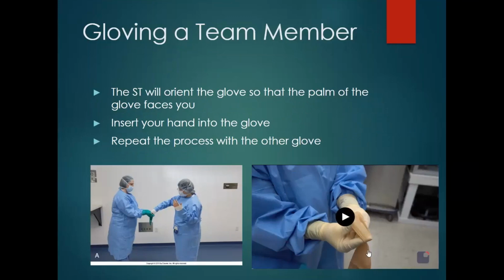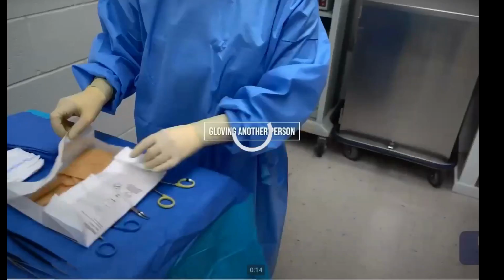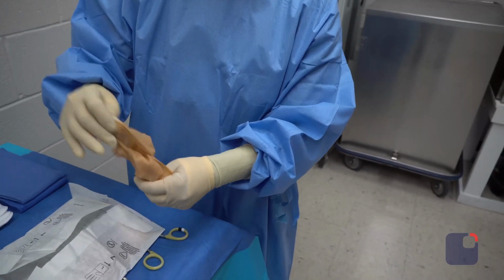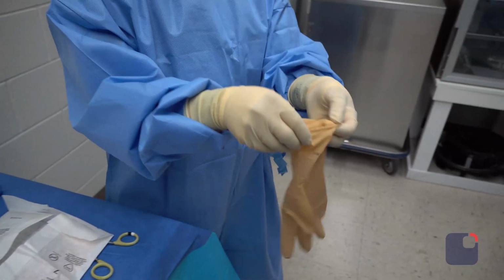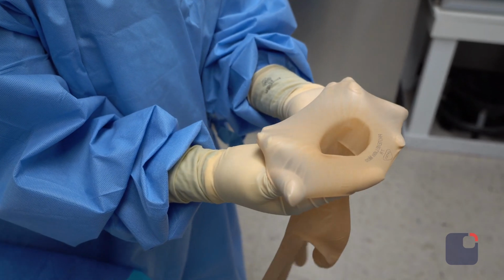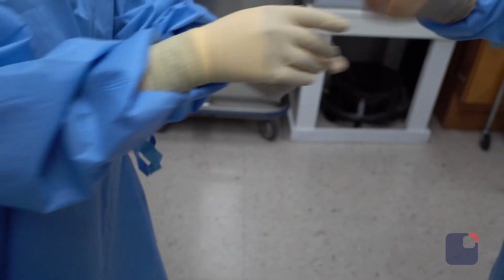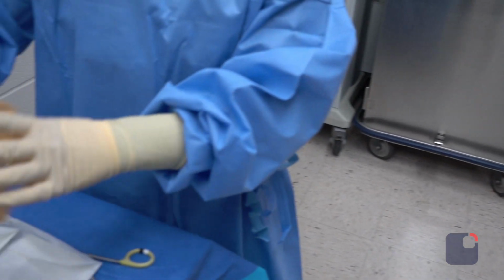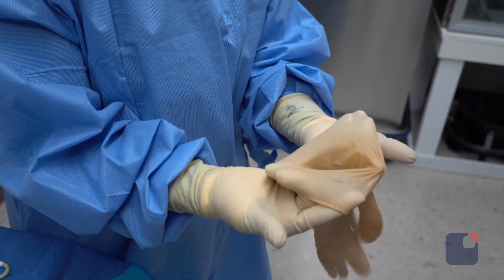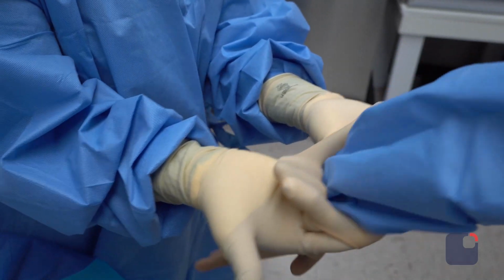So we have a little video here of what the surgical technician will do for you as far as gloving. She will open the glove, place her fingers underneath to create that hole and opening for you, and you slip in. Again, it's almost like a scoop motion where you slip in your hand and come immediately back up. Repeat for the other side.